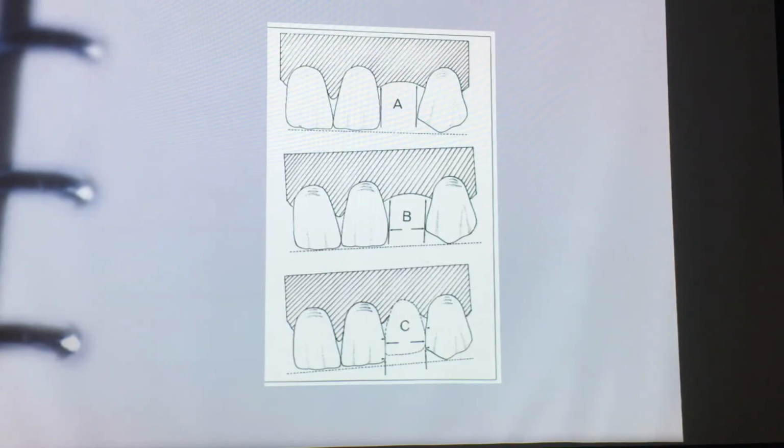Now, for our first case, Kennedy Class 1, it will be the distal guide surfaces of 3.4 and 4.4. The second model would be similar, but we're going to do different major connectors. So basically, you get a couple tries at the first Class 1.